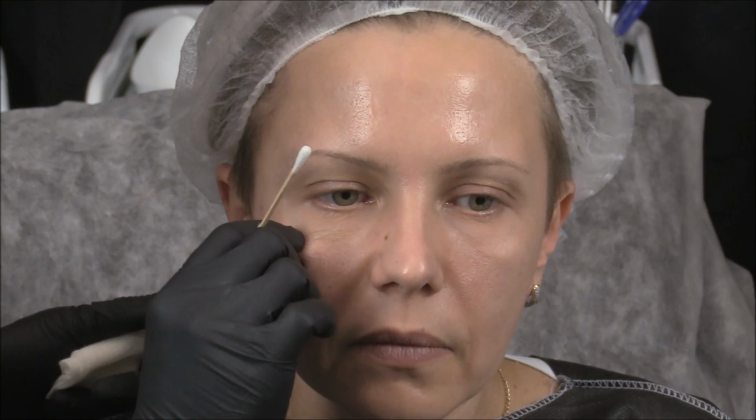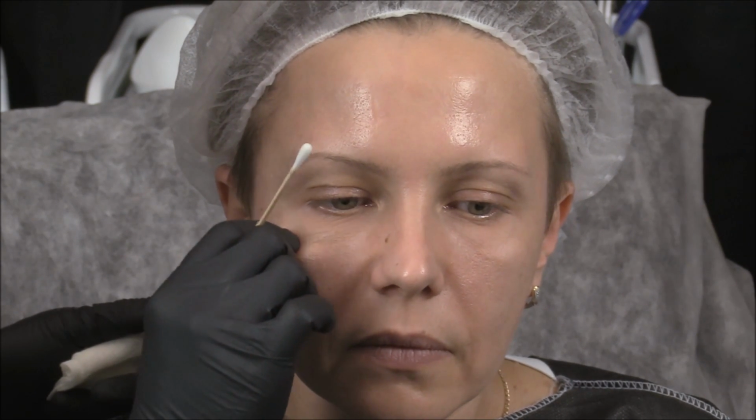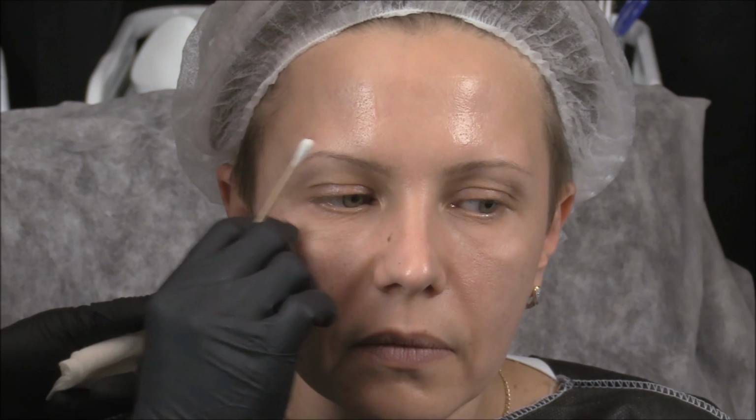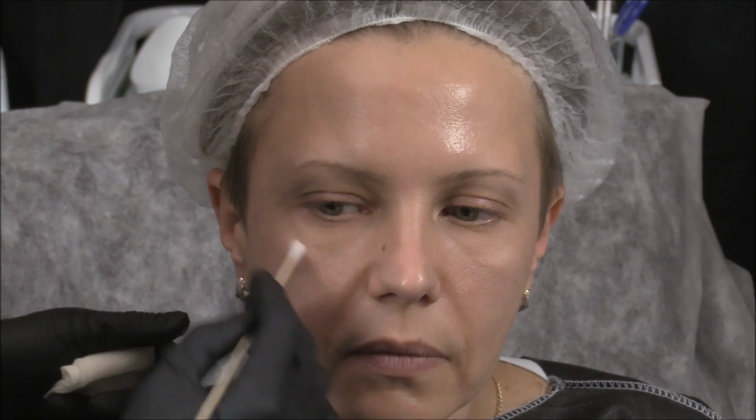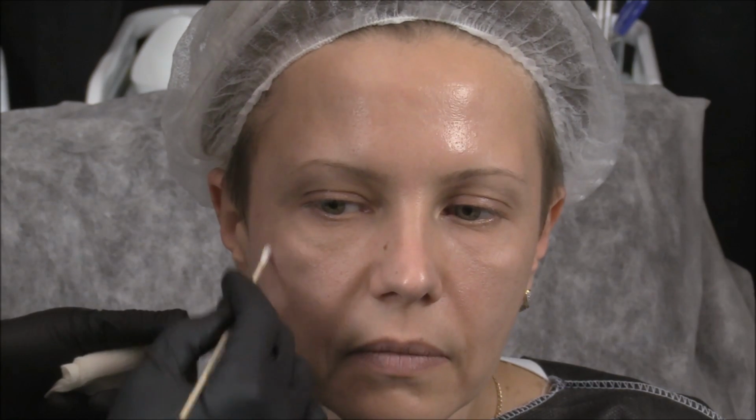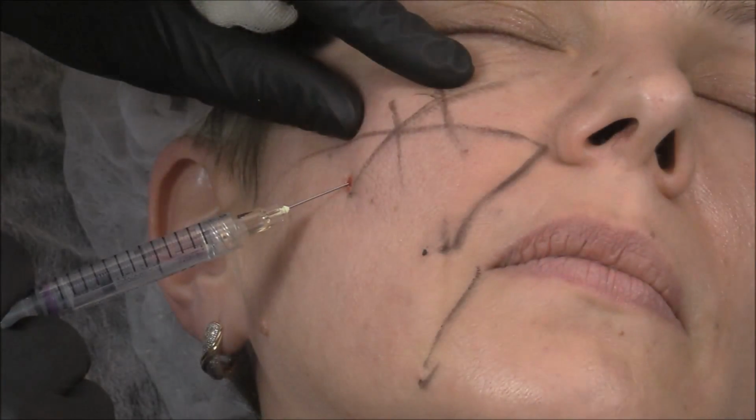So you want to point this out to your patients, because otherwise they are going to come back to you in 2 to 3 weeks' time. They're going to think that you've injected filler there, especially if one side is more severe than the other side. So that's number 1. Number 2, another reason why you have to point it out to the patient is we are never 100% symmetrical. If one side is more severe than the other side, they are likely going to think that you've accidentally injected filler into the other side.